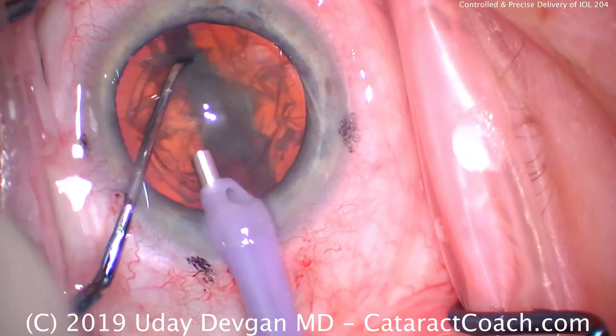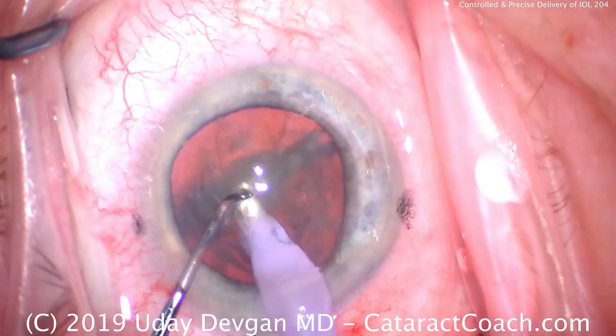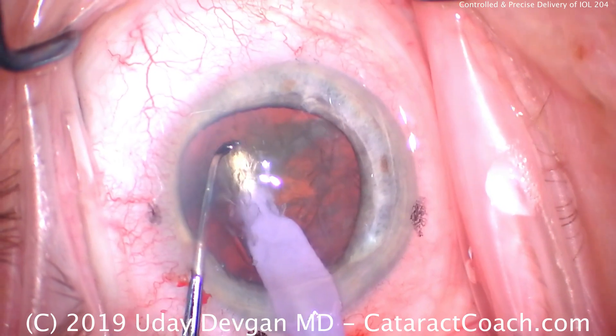Bring the instruments together and apart and really separate the halves — that looks great. Now let's rotate the nucleus and chop it more. So let's fast forward now to the end of the case.